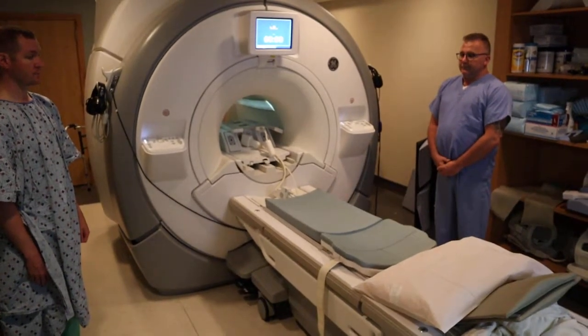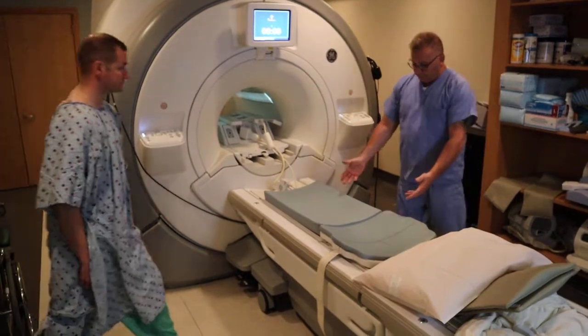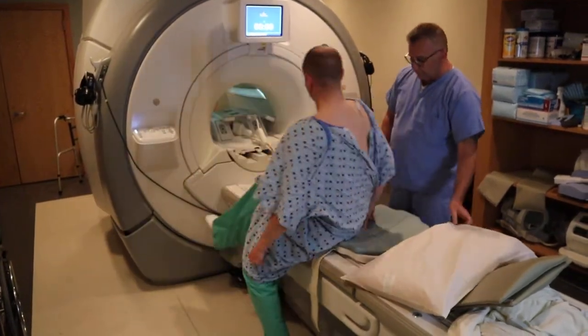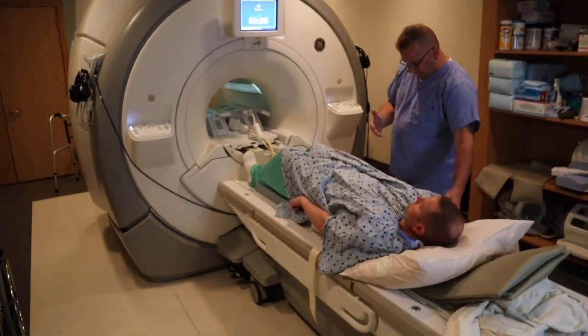We're now going to position for an MRI abdomen. Very similar to the hip, you're going to use the eight channel coil, but you're now going to bring it more superior to cover the abdomen.